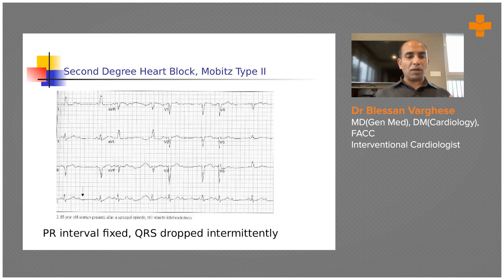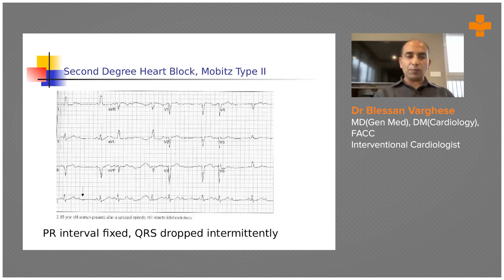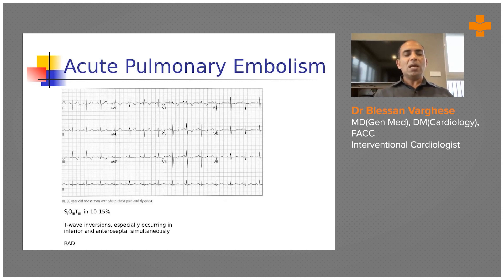This ECG shows a second-degree heart block. The PR interval is not progressively prolonged, but there are P waves not followed by QRS complexes — this is Mobitz Type 2 second-degree heart block.